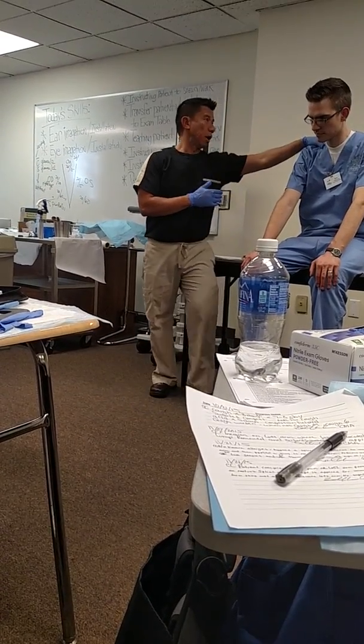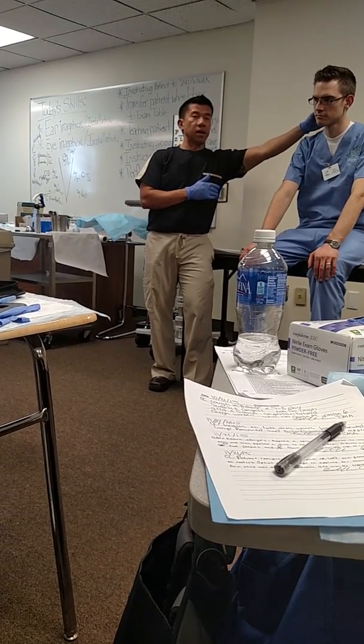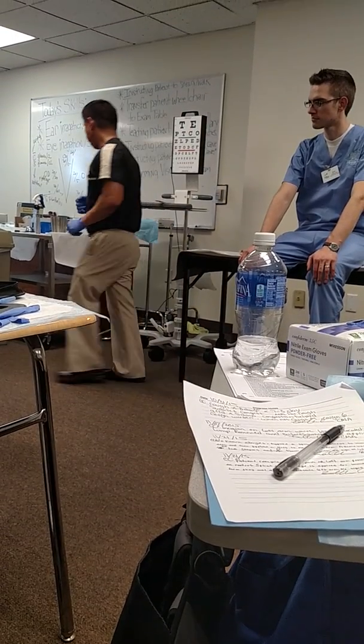Again, you cannot do ear wash or ear lavage without the doctor's order. Then you'll check. Okay, now doc, it looks like it's moist now. It looks like soft now. Yeah. Oh, it smells good. What is that?